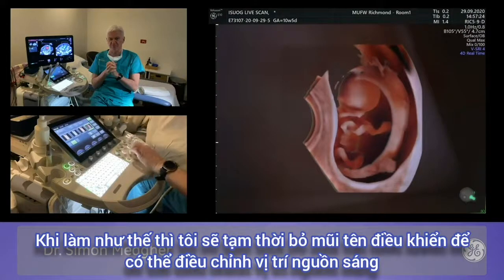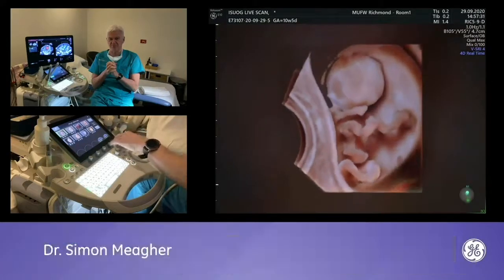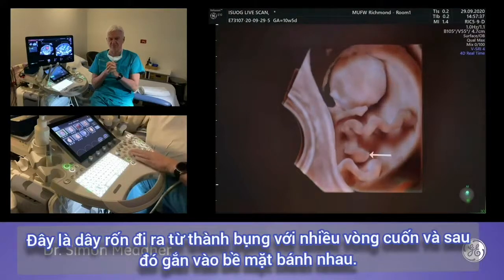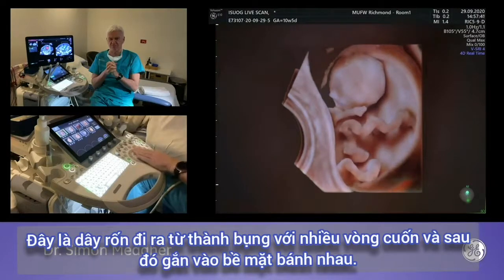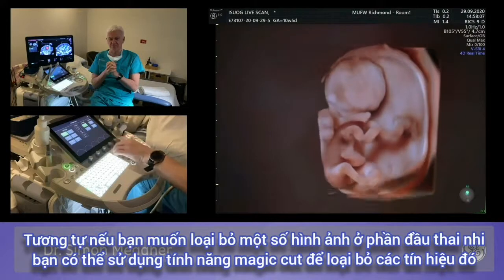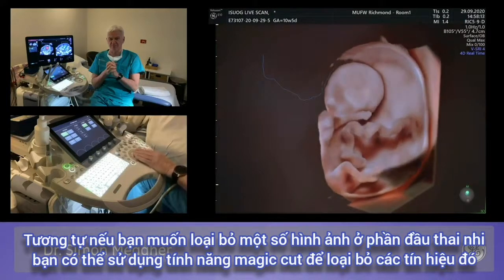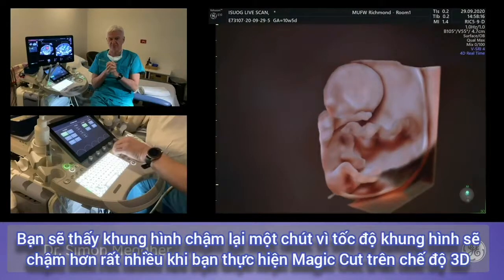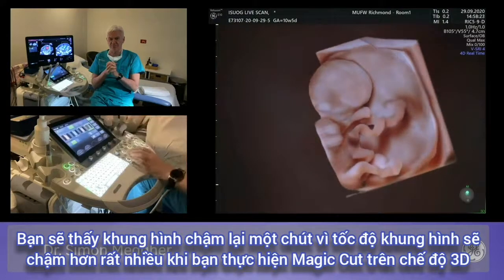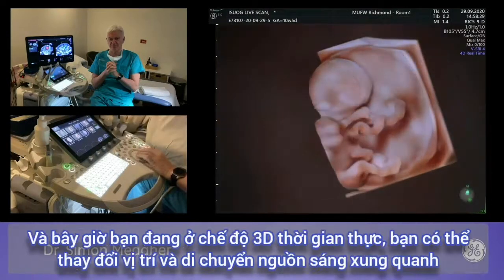Rotating around the y-axis reveals more definition of the anterior abdominal wall. Using magic cut to remove unwanted echoes from the fetal head region — noting a slight delay compared to standard 3D magic cut due to the slower 4D frame rate. If the fetus moves into a cut area it disappears from screen. Now in real-time 3D, you can edit and move the light source around. You can assess the feet for proportional size — both feet are juxtaposed — and see the legs. It is too early to determine gender.